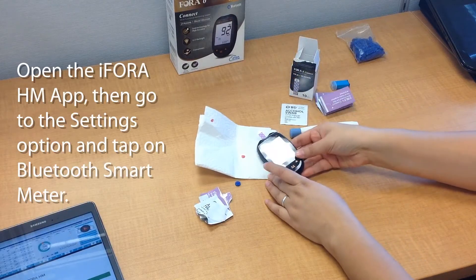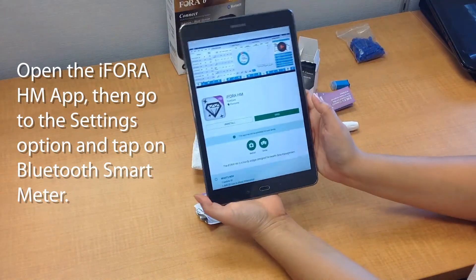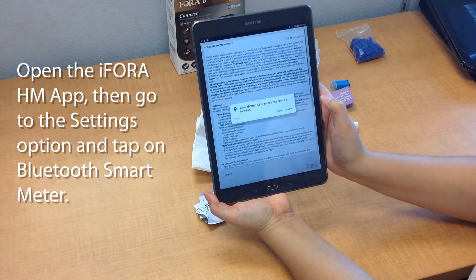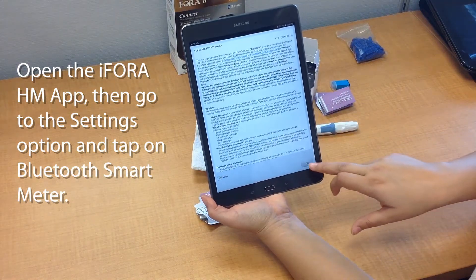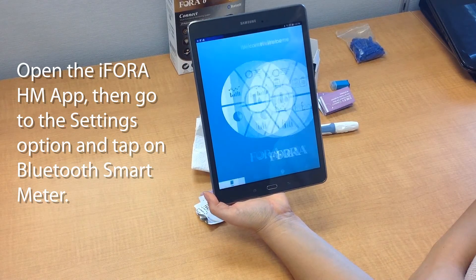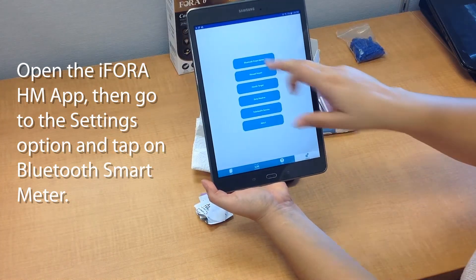Now open the app that you downloaded — the iFora HM app. You'll have to complete the setup: allowing or disallowing permissions and agreeing to the terms. Hit OK, then go to the Settings tab and Bluetooth Smart Meter.